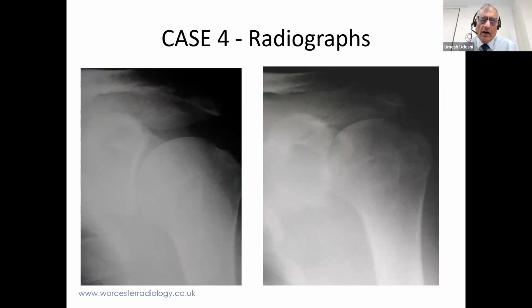So this is why I've had one case of septic arthritis in 35-odd years of doing arthrograms, and that patient was poo-pooed by the GP when she went to complain about severe shoulder pain. They said, "Oh, well, you've had an arthrogram, you're bound to have a bit of pain." And then it was very, very late before she actually turned up at the orthopedic clinic again. And she was a young sports-keen person, and we did not do her any favors at all, which is why now, with every single patient I do an arthrogram on, I tell them that they should not get severe pain.